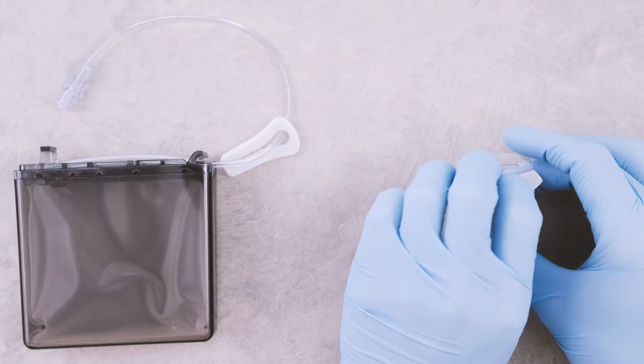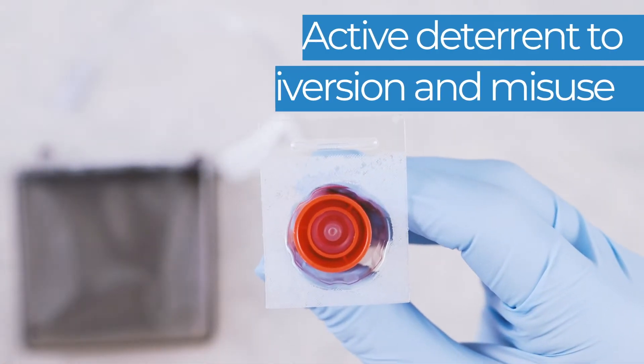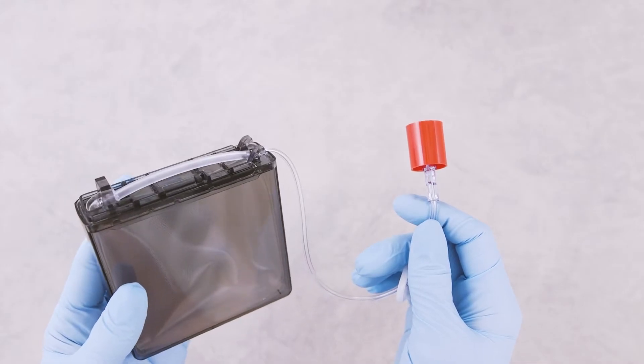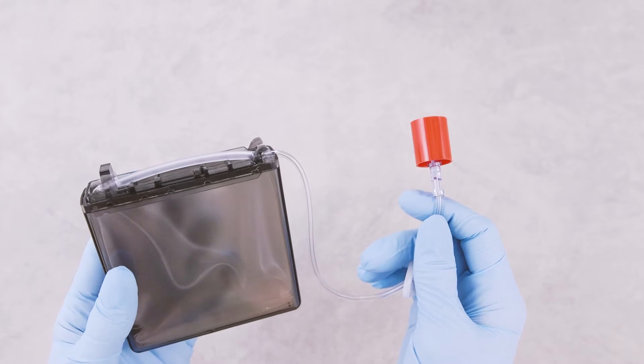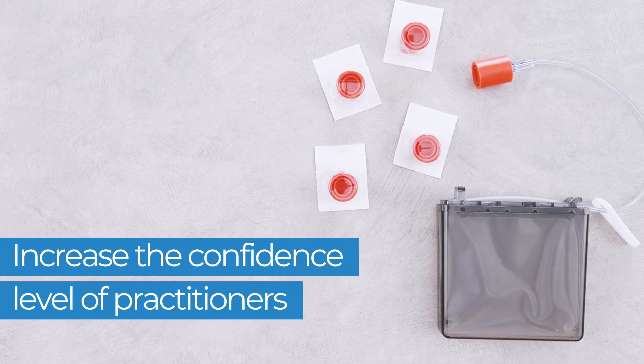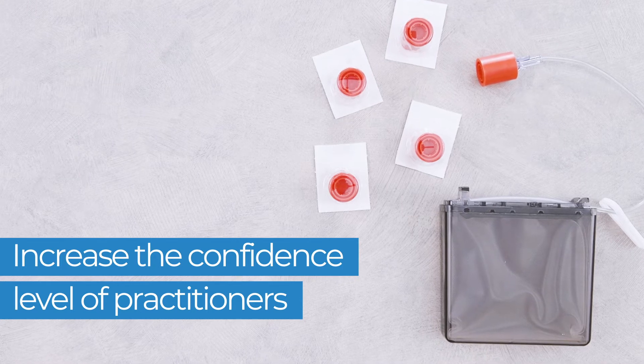The PrepLock Tamper Evident Cap with Male Lure Lock provides tamper evident closure to devices that feature an ISO compatible female Lure connector, such as CAD medication cassettes. Tamper evident caps help to ensure that medications arrive to patients uncompromised.